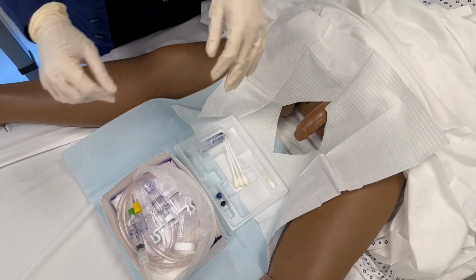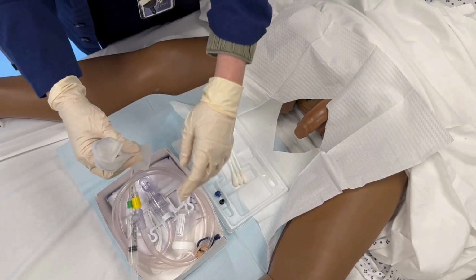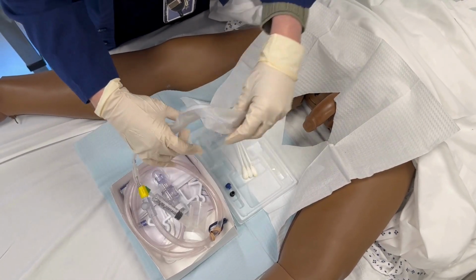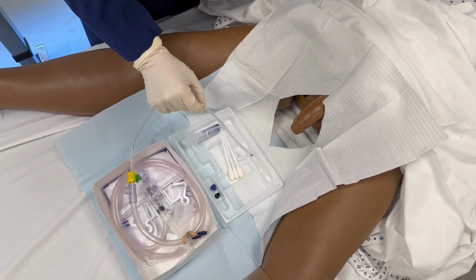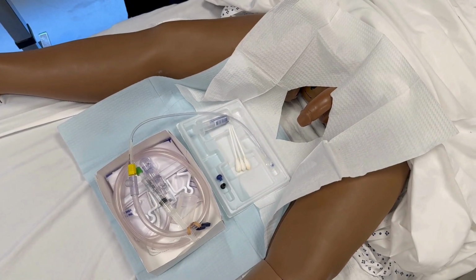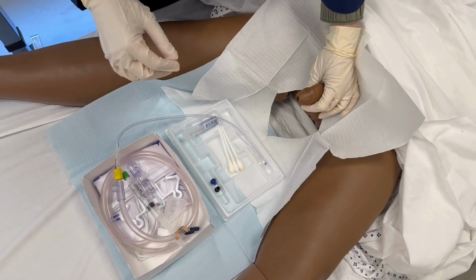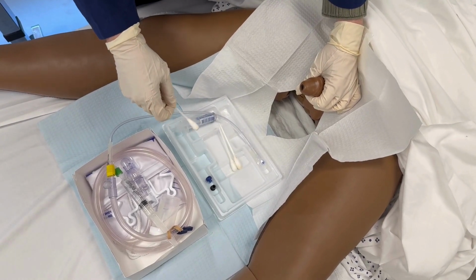Remove catheter from the sleeve and place in lubricant. With your non-dominant hand, lift the penis, retract the foreskin if present, and identify the meatus.